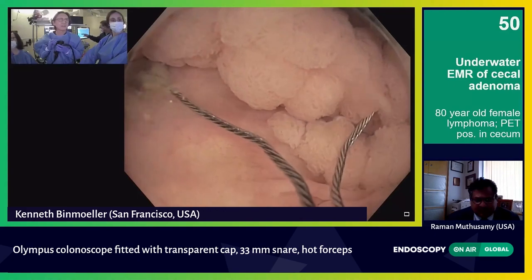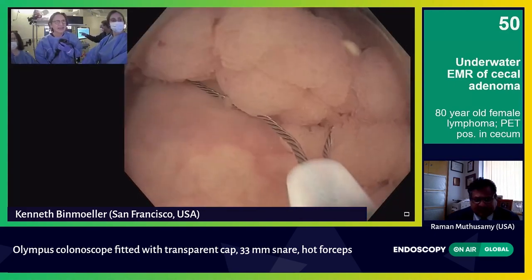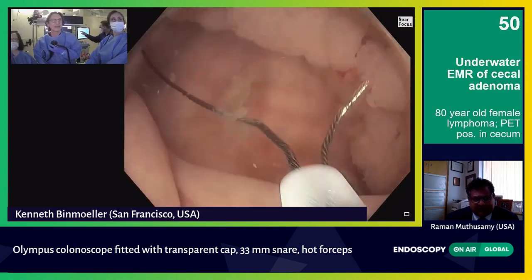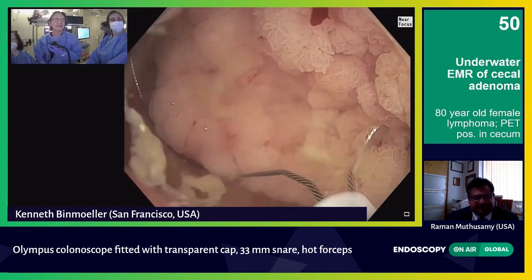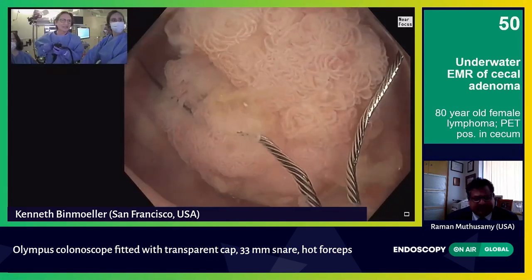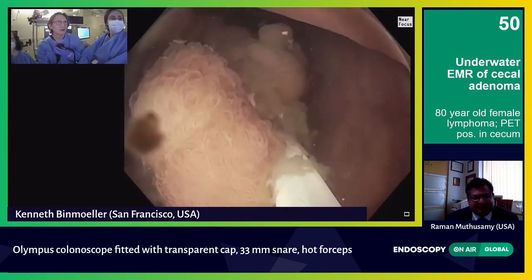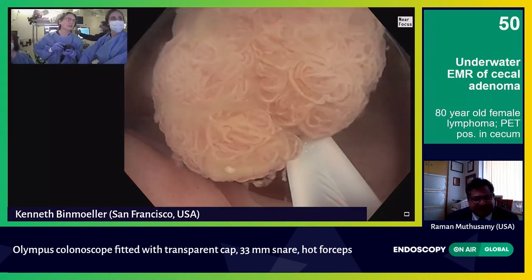I may have to do this piecemeal, but really more like a trimming of the side. I'm torquing and seeing — this takes patience, this takes a little bit of time. You can see it's overhanging quite extensively on the right side, so it's questionable whether I'll get that. There's a lot that overhangs. Let's see if I can just scoop this up here and then push in. There's a little paradox here, but a lot of this is floating — I'm really taking advantage of this floating effect.